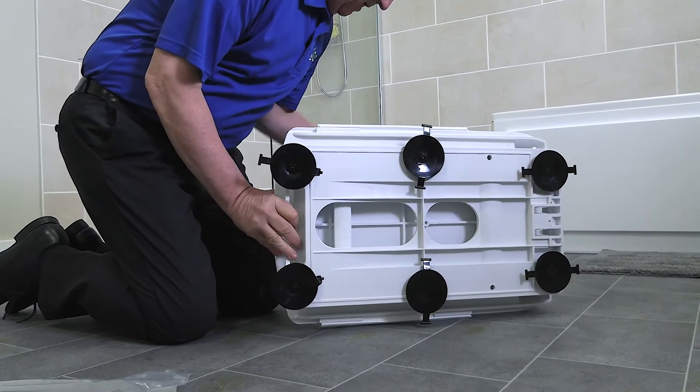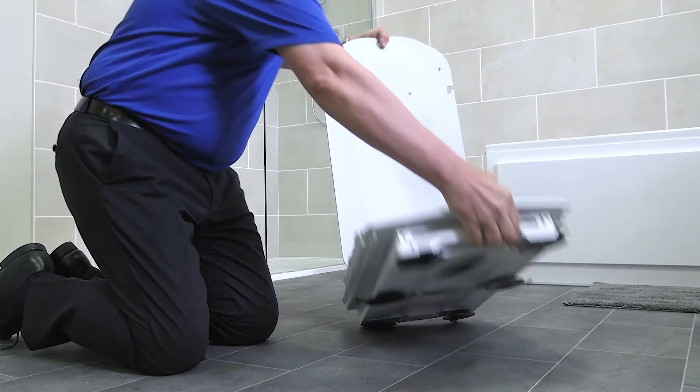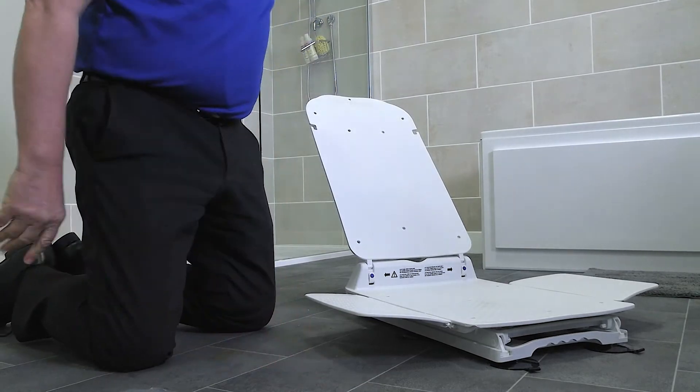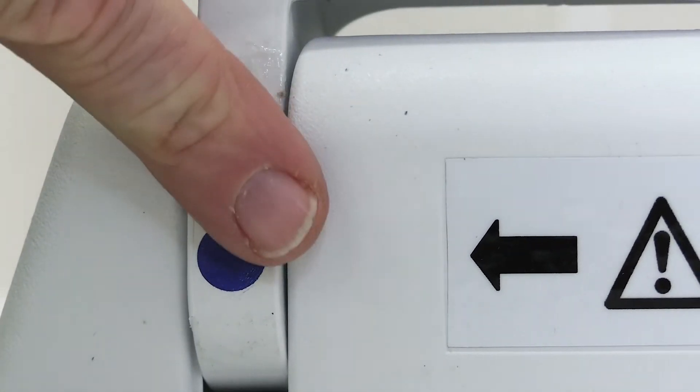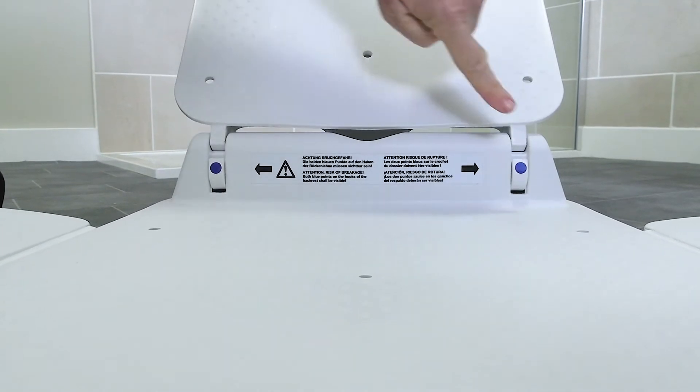Next, lift and tilt the Bath Lift into its upright position and open up the side flaps. Always ensure the backrest is connected to the base correctly. Two blue dots must always be visible. Never operate the Bath Lift if only one of the blue dots is visible.